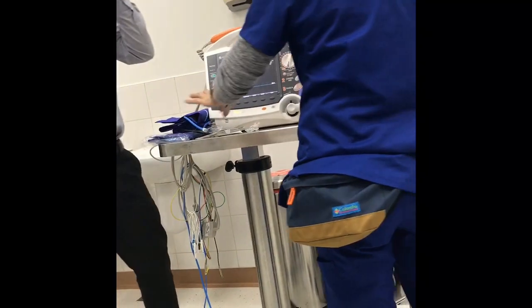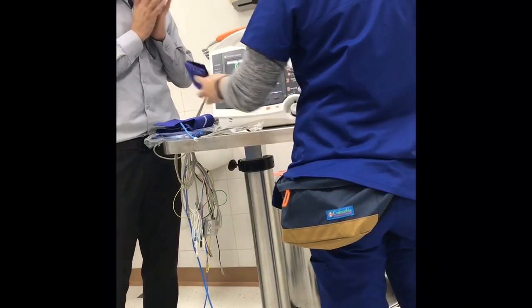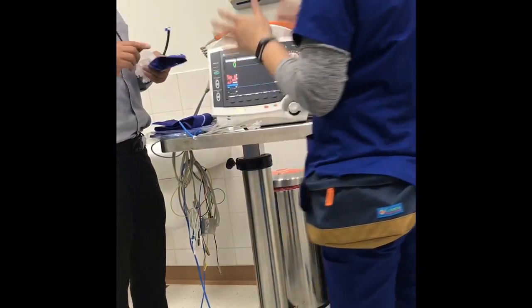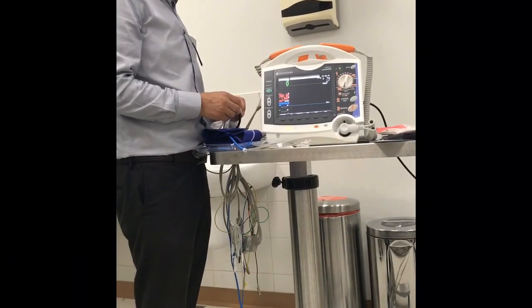Change only the connector, can we apply it as well? Yeah, if it is a cuff and one hose, not a tube. One hose, yeah, if it will fit. But as a manufacturer, we recommend using our own.